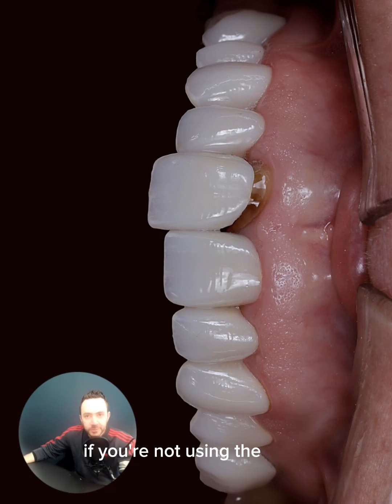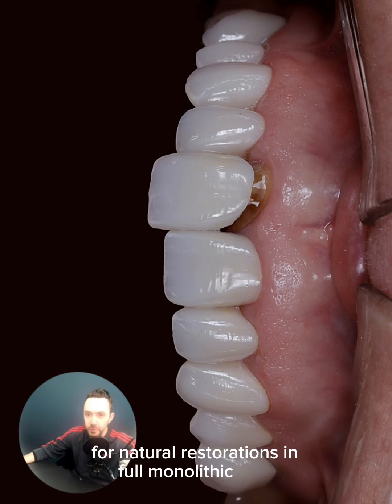If you're not using the multi-press, you're probably missing out for multiple reasons. What you're looking at here is a case at the insertion phase. The multi-press material is a top-notch solution for natural restorations in full monolithic form.